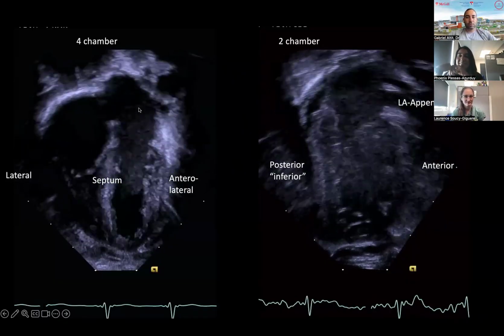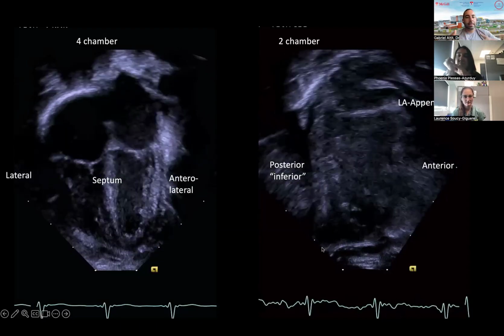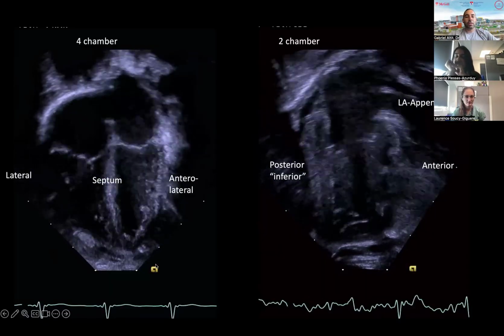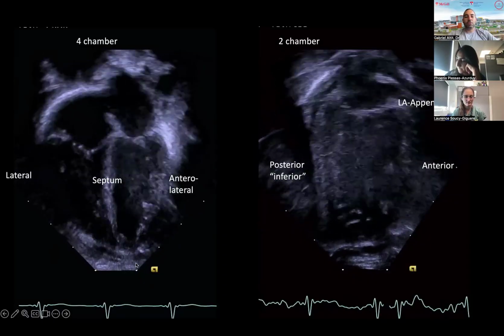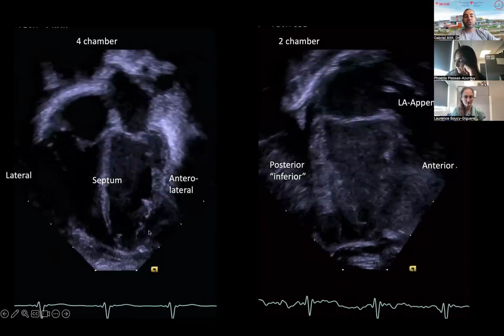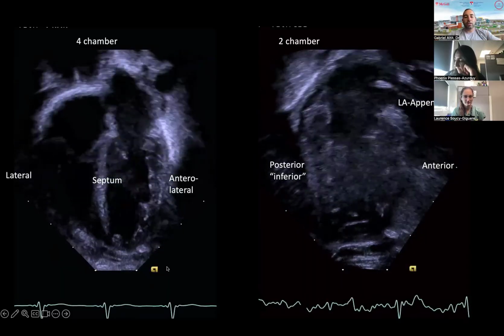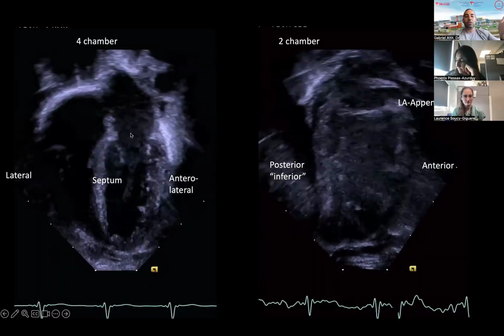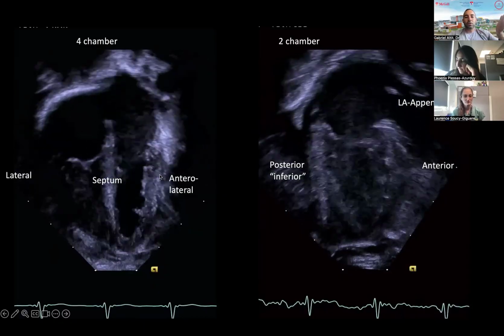So let's look at the four-chamber view. This is the classical view that we do in the pediatric echo world. This is a patient here on the side. Typically, most machines will provide a calibration: you have the probe here, you have the marker here. If the marker is towards the left of the patient, this ventricle is on the left of the patient. And if it's a confirmation of the left ventricle, then you know the left ventricle is on the left of the patient. Okay, this looks like an LV.